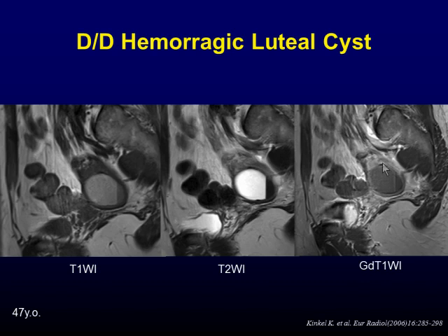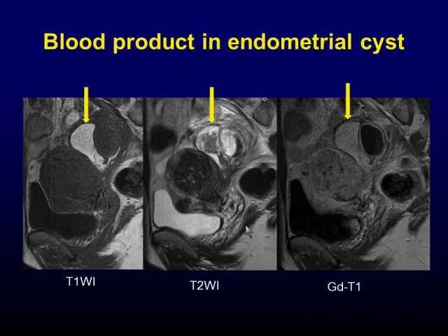One of the differential diagnoses of endometriotic cysts is hemorrhagic corpus luteum cysts. In this case, the left adnexal cyst shows high signal intensity on both T1 and T2-weighted image. Hemorrhagic cysts are usually unilocular, in contrast to endometrioma, and do not exhibit shading on T2-weighted image. We sometimes find low signal intensity on T2-weighted image and high signal on T1 within the cysts, which is a clotted blood product after cyclic bleeding for years.